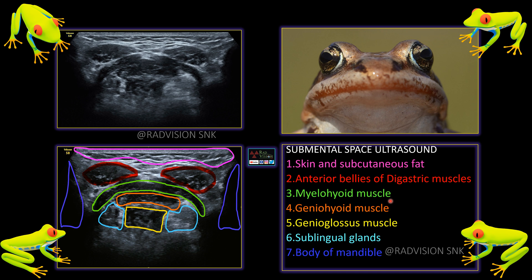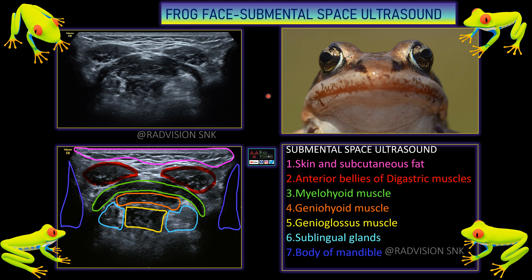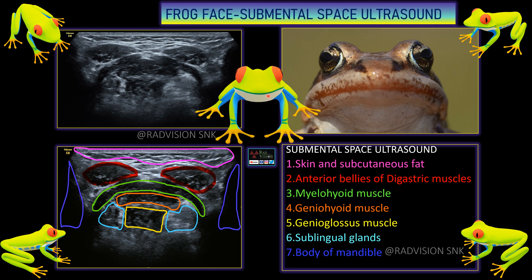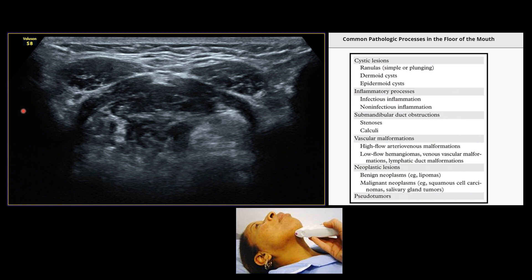As seen previously, these are all the various superficial to deep structures to remember in the frog face view or submental space ultrasound view. This is the typical frog face view. The probe position shown here is what we use for the submental space or floor of the mouth lesions.